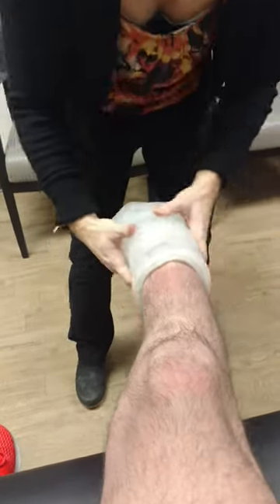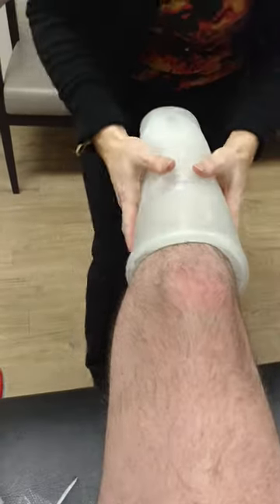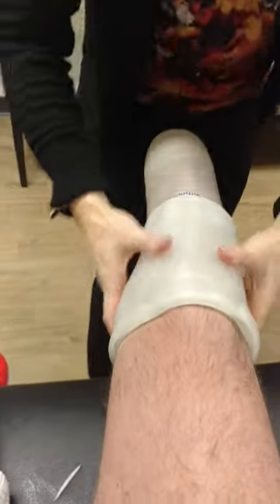But as easy as I got those blisters and skin irritations, it's been... holy crap. So this is what we cast it for last week — I didn't really understand, now I do. Flip that over, just wipe off. That dries in a powder, so if you're wearing black all the time, you get it on black. It does kind of dry in a white powder, so you get a white residue.